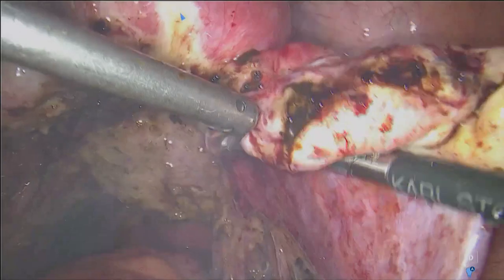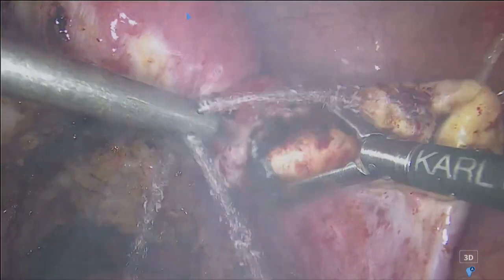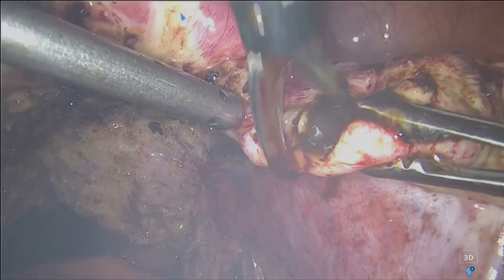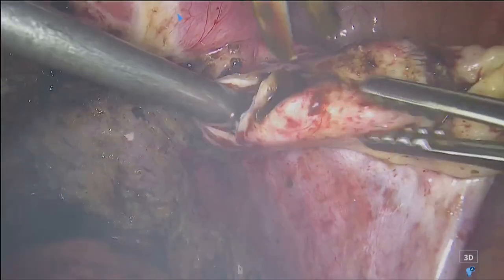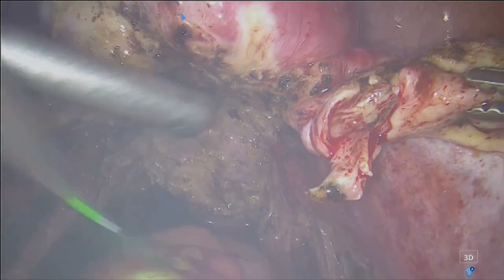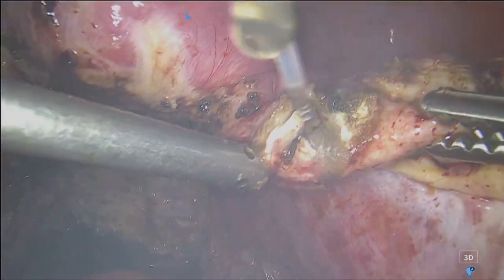It looks like a small scissor, so we open it better. We open a little bit the small endometrioma with the scissor, and then we start to use the laser treatment, the vaporization of the endometrioma. Okay, so this is the very small endometrioma. And now we are ready to go again inside with the laser, and we can treat inside the small endometrioma with the coagulation of the small capsule.